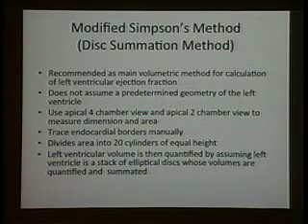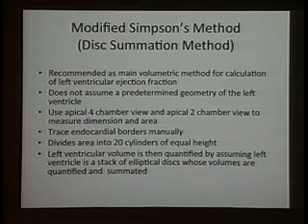The method of discs is a little bit different, because now you're going to work in 2D. Instead of a unidimensional mode, you're going to do it in 2D. And you're going to get it preferentially in a 4-chamber view, which you already have seen. We can do it in the apical views. Or you can actually tilt the probe 90 degrees and get a 2-chamber view. And ideally, because now you're doing 2 measurements at 90 degrees to each other, you should be able to capture if there's any major wall motion abnormality, and it may be a better representation of what's going on.